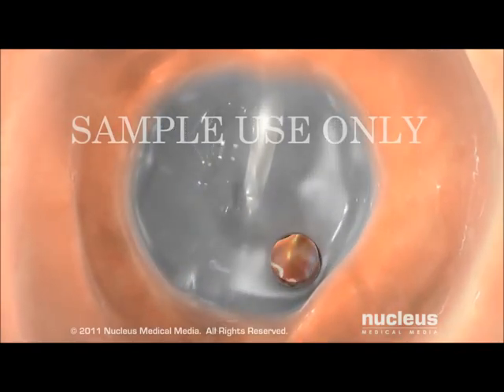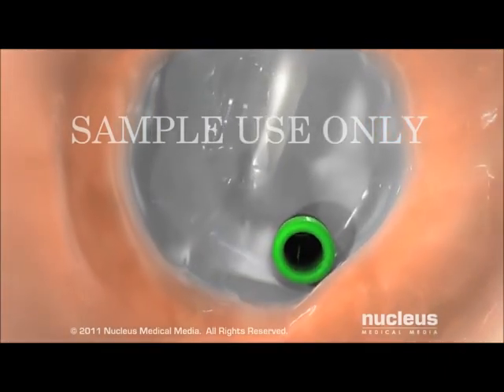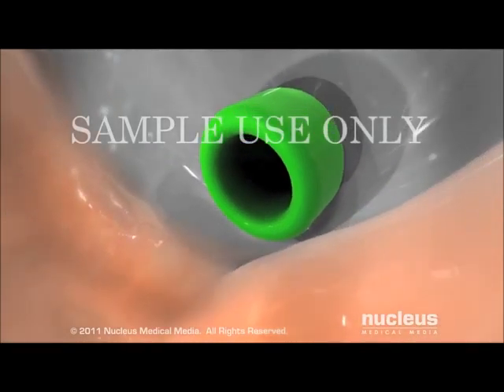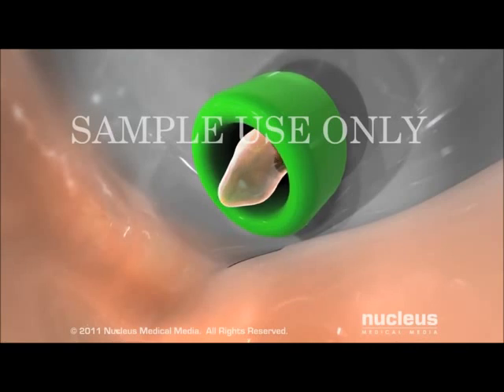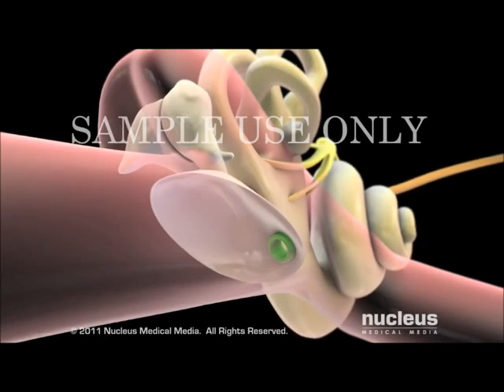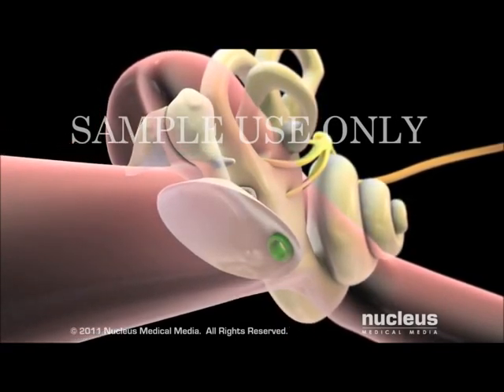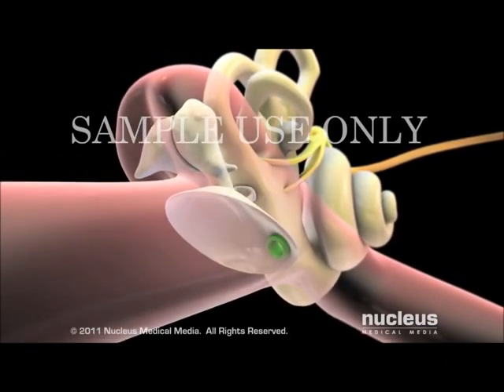in the middle ear. In many cases, the surgeon will place a ventilation tube or PE tube through the incision. This small tube will drain any fluid that collects after surgery and allow air into the middle ear to help dry it out. If necessary, the surgeon will repeat the procedure on the opposite ear. The entire procedure takes 30 to 60 minutes. The incision in the eardrum will heal itself.